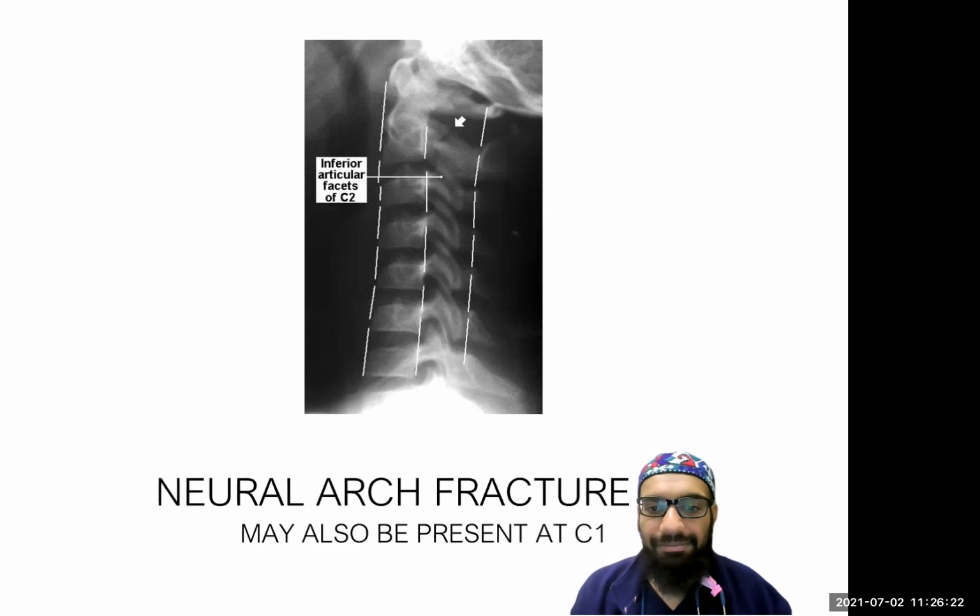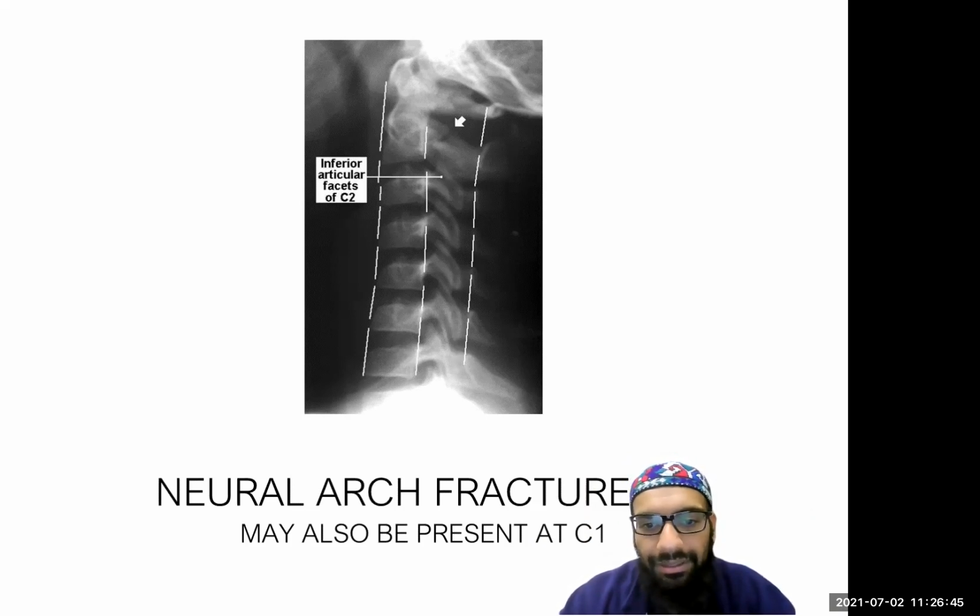So the thing with C-spine injuries, especially in the emergency department, is that you can learn it from a radiology point of view, or you can learn it from an orthopedics point of view. But in the emergency department, we need to work fast and we need to work accurately, which are two things that don't often go well together. Generally, if you work accurately, it takes you time. And if you work fast, you tend to be inaccurate. So we need to develop ways to look at these types of x-rays that allow us to be accurate and quick.